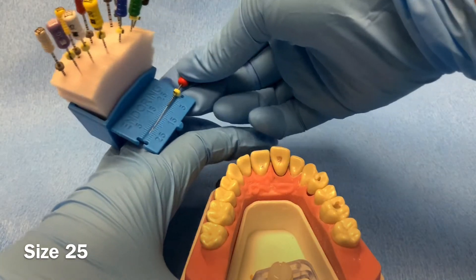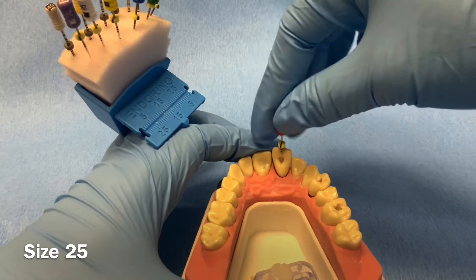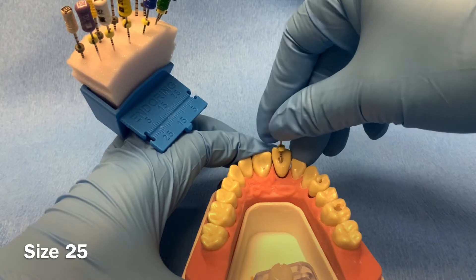Repeat the process using increasing file sizes 25, 30, 35, and 40. On this tooth we are cleaning and shaping to a master apical file size of 40.